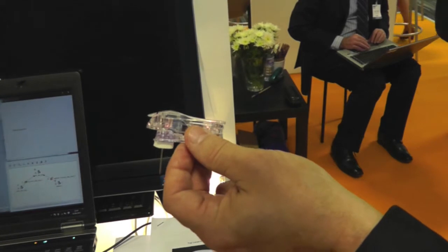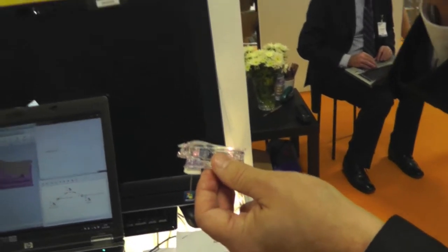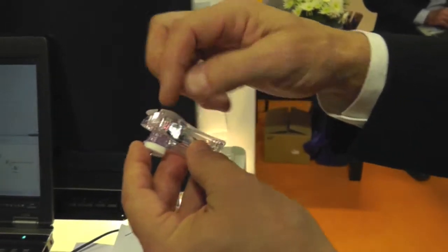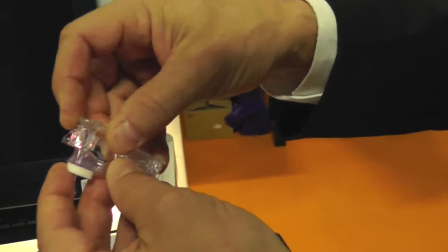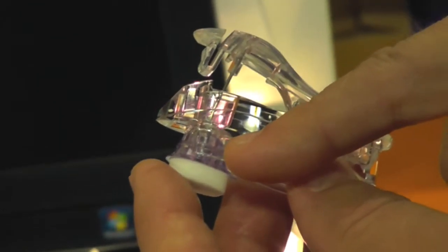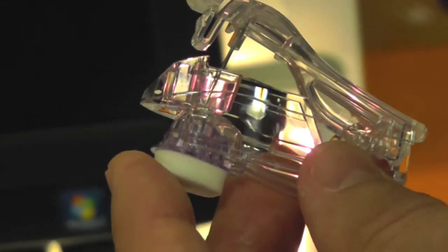And all from a click. So the patient knows when they hear the click that they in fact got a reliable connection. And then another example here is that there is a seal surface that, again, you can see is down in this area, and that seal has to be maintained, and there are some interferences there we want to guarantee, but again we have this variability.